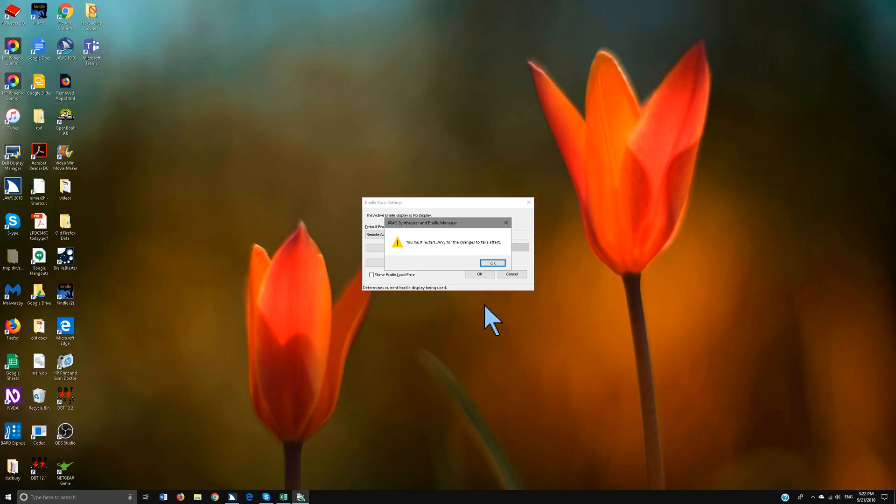You're going to turn off your Braille display if you have it on and then you're going to turn it back on. Your Braille display always needs to be turned on before JAWS is turned on.